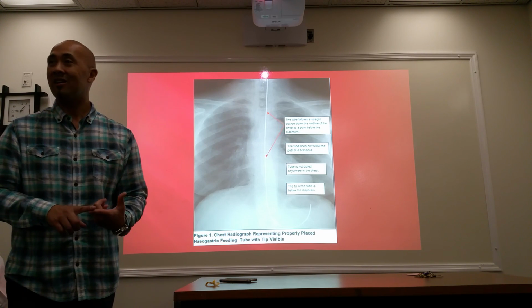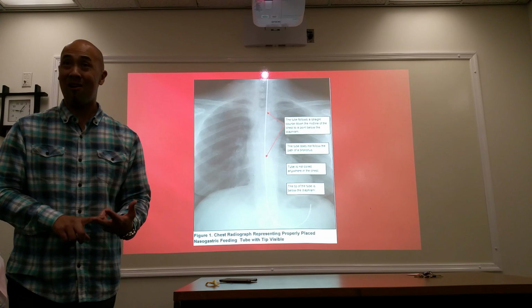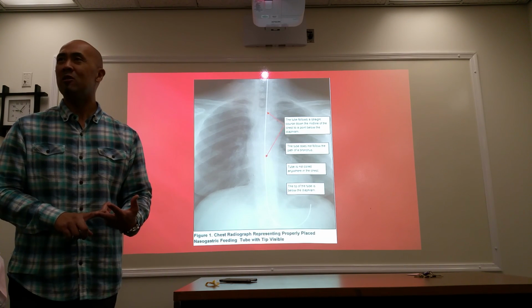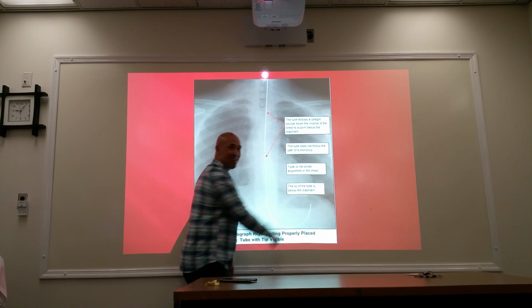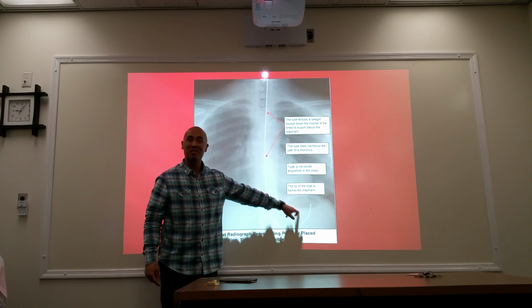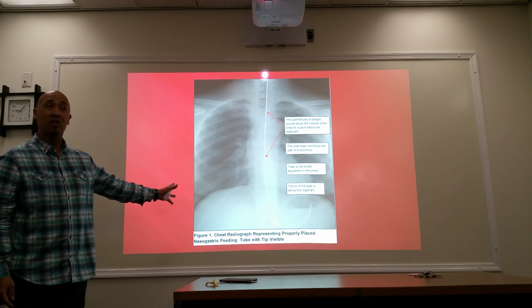You got solid contents from food and liquids, and air. That's why you belch. You got air in your stomach and you burp. Air radiographically is black or gray. That's the stomach. So we know it's in the stomach. Good placement? You guys agree? Is it a good placement?